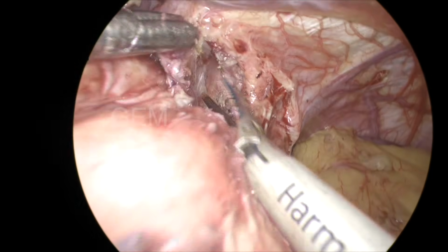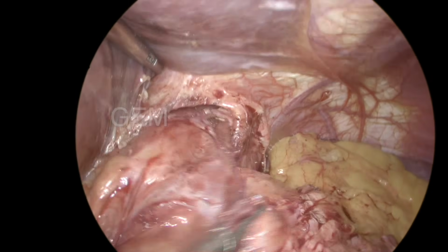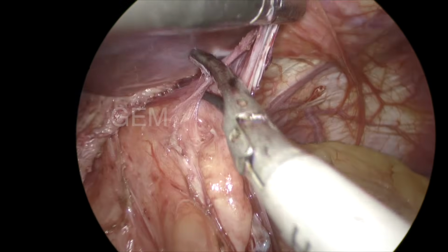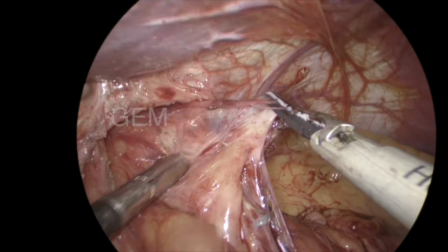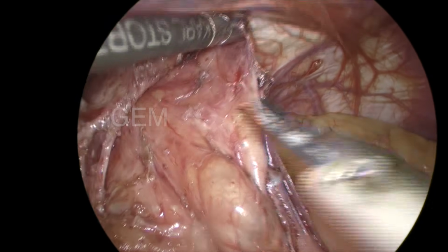When you're doing a sac excision, you have to concentrate on two things. One thing is the vagus nerve, the anterior vagus nerve. The second thing is the esophageal wall. We should not injure it. Now you can see the entire esophagus is coming out. Once the sac is coming out, the lower esophagus has come out. I'm just checking the anterior vagus. You can appreciate the anterior vagus.